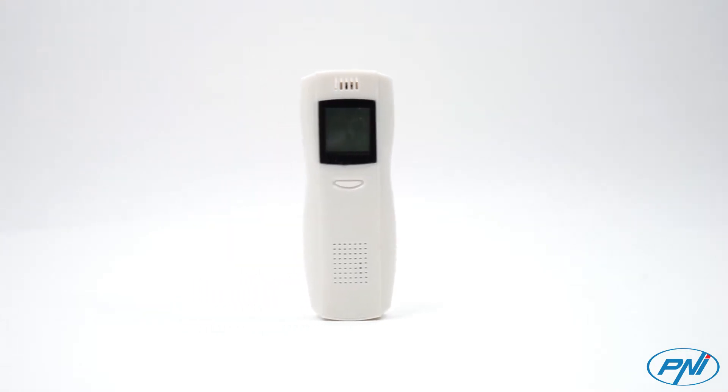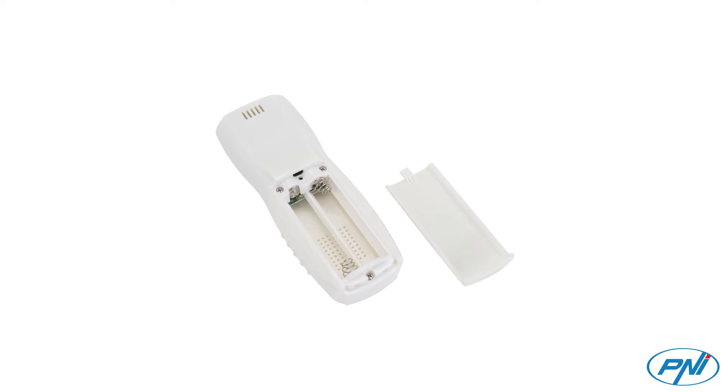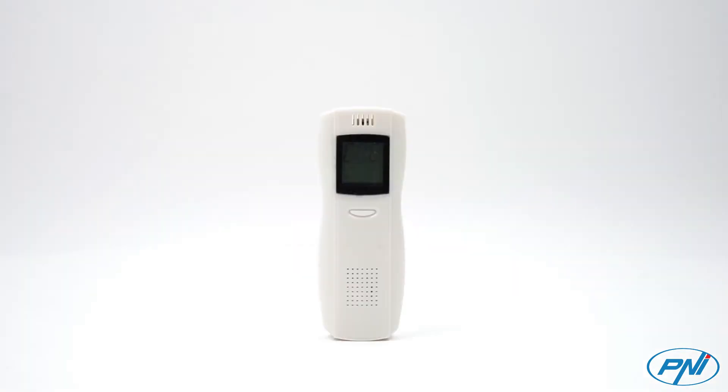The product is small and very easy to use, powered by two AAA batteries and equipped with an LCD display that provides information such as the device warm-up time, battery level, and test result.